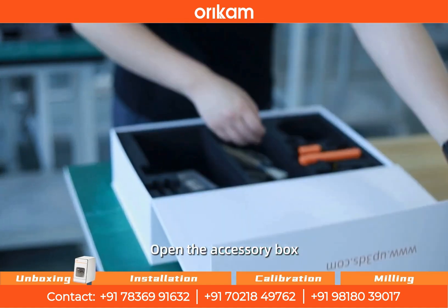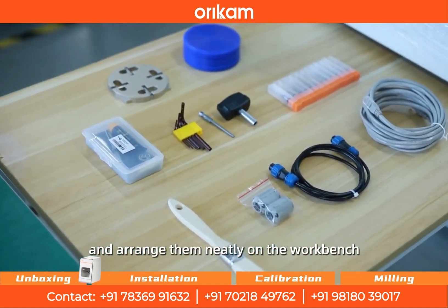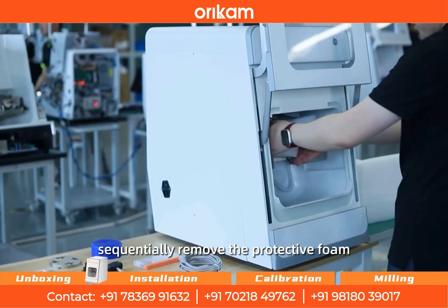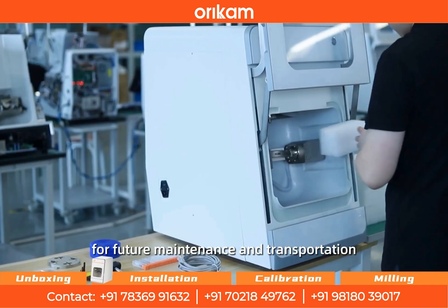Open the accessory box, take out all accessories, and arrange them neatly on the workbench. Open the working chamber door and sequentially remove the protective foam used inside, placing it properly for future maintenance and transportation.